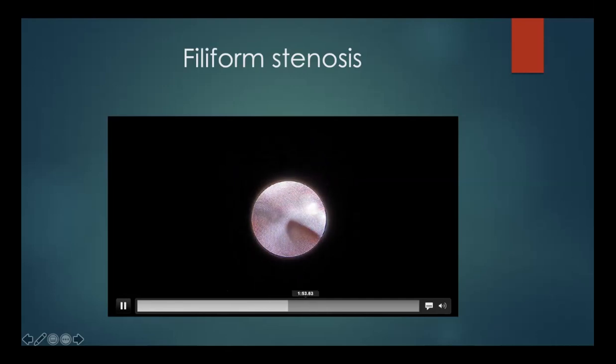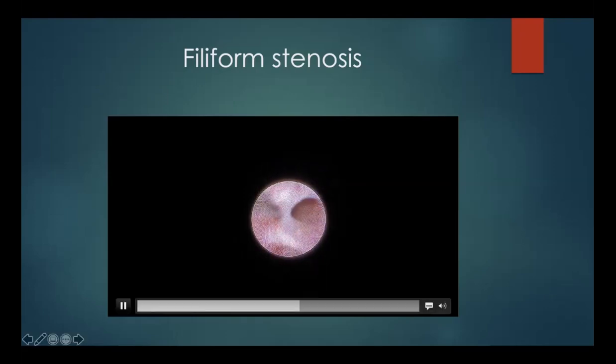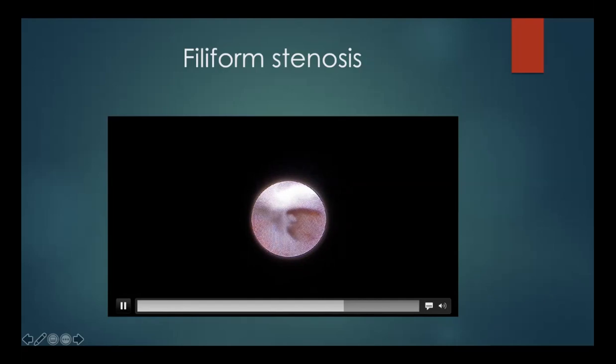So this is where we are trying to perforate the web-like structure, and basically you try to go all around it. You go around it, making multiple puncture marks and then trying to join them together. This tends to increase the diameter by quite a lot, and once you've increased your diameter, you know that your problems are going to get resolved for quite a long period of time.